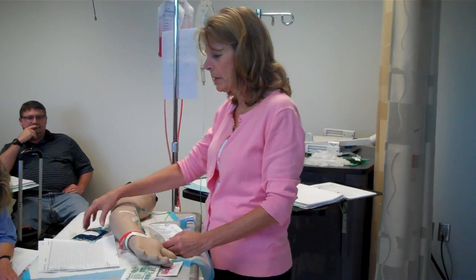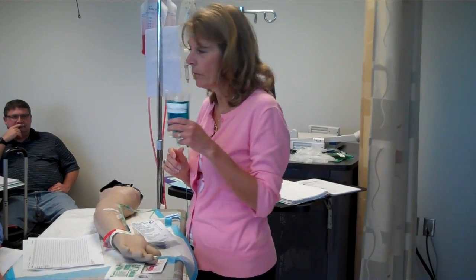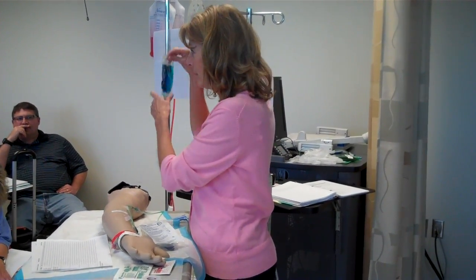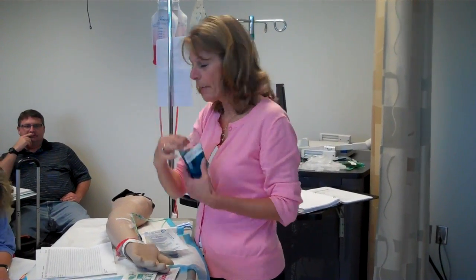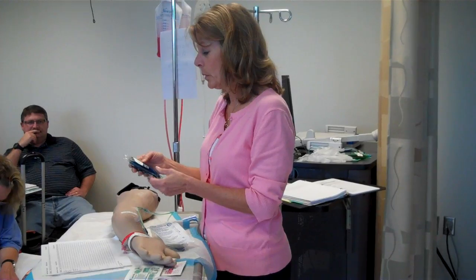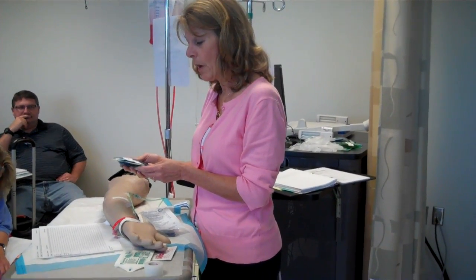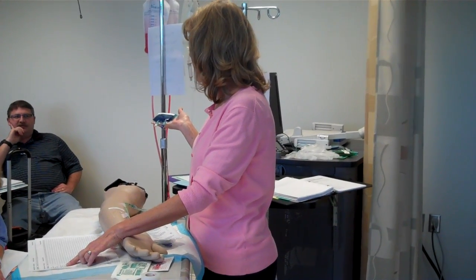So let's go ahead and check our 5 rights. Alright, so the right drug is ampicillin. What's the right dose? 250 milligrams. It's on my MAR. It's on your bag. Remember, you will be pulling your bags and your supplies if you are testing out on this one. So I'm going to go and pull my ampicillin, 250 milligrams. My right patient is John Jones. My route is IV piggyback, and my time is 12:30.